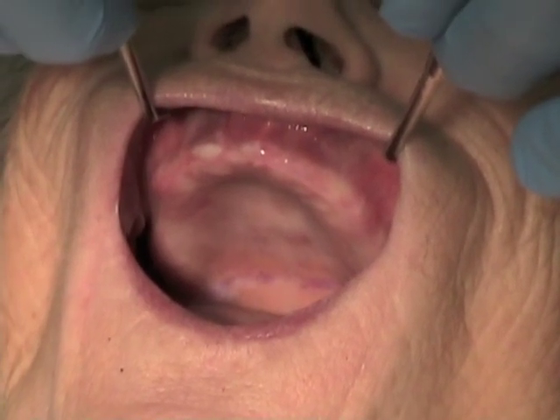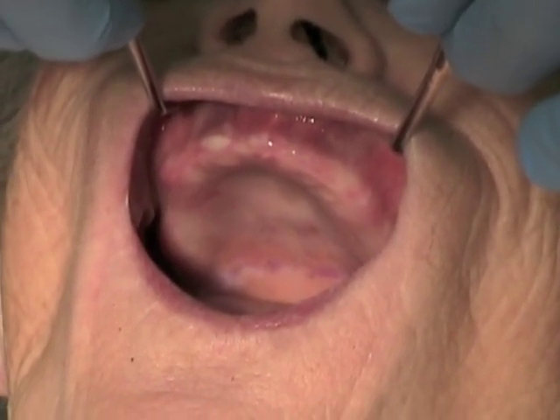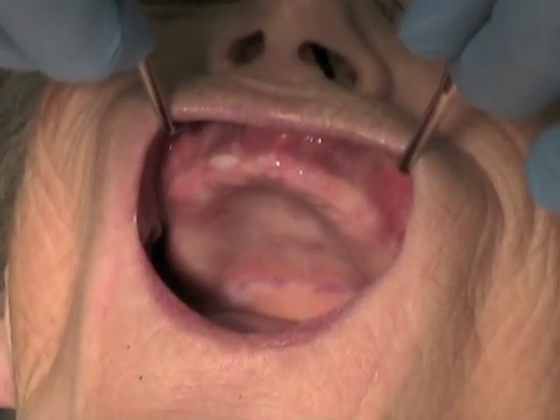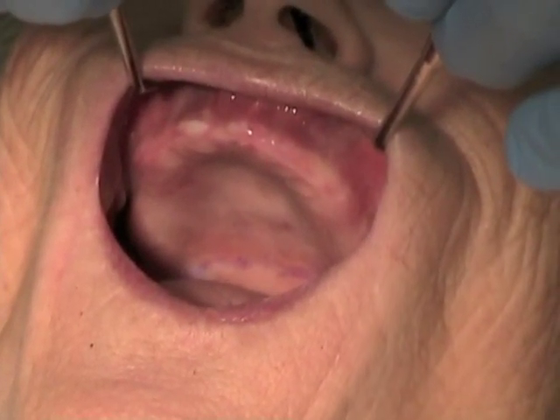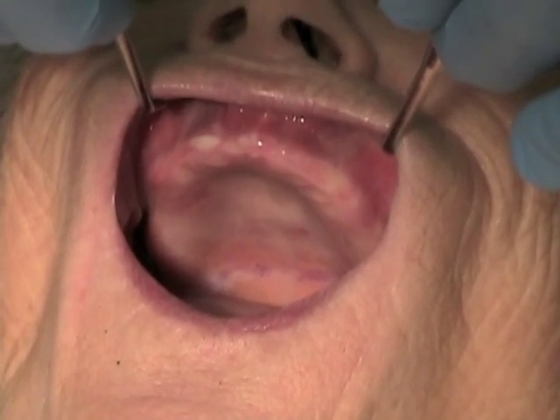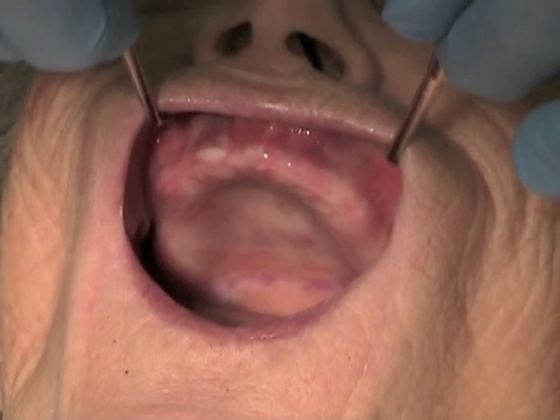The mirrors are placed to retract the lip far enough anteriorly that you can just see all of the anterior vestibule and the posterior vestibule at the same time. Do not place the mirrors so far anteriorly that the cheeks obscure the posterior vestibule. The goal is to see all of the vestibule at once.